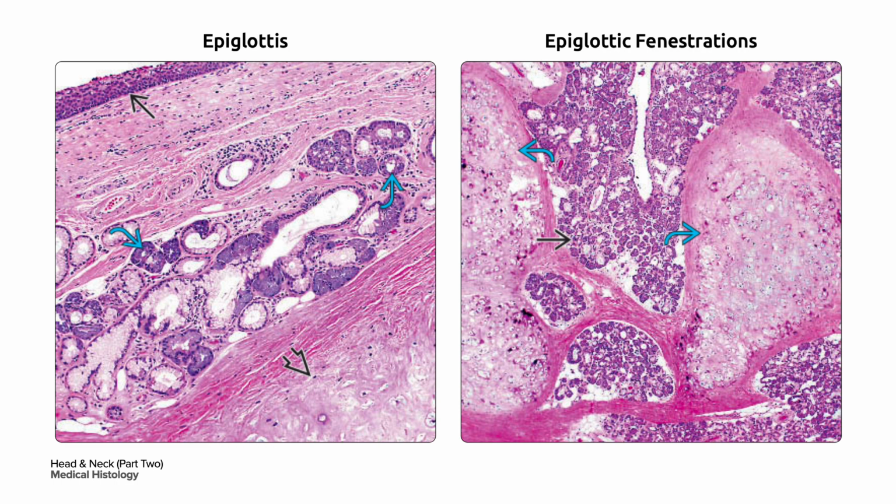On your left is the epiglottis in adults, which is typically lined by stratified squamous epithelium in single black arrow, but patches of ciliated columnar epithelium may be present as well. Numerous submucosal seromucous glands in curved blue arrow are present in the supraglottic larynx and typically are situated near the epiglottic cartilage in bold black arrow.